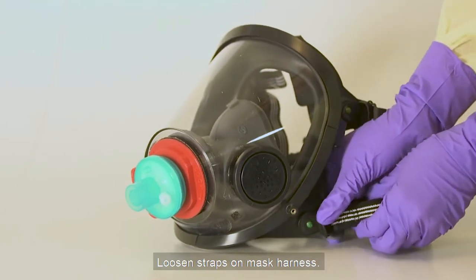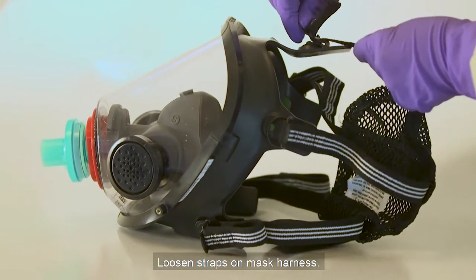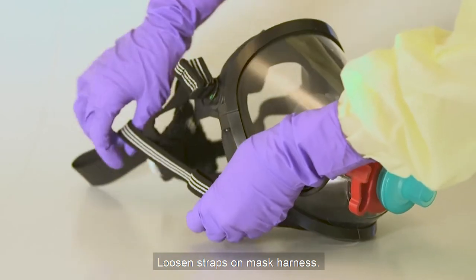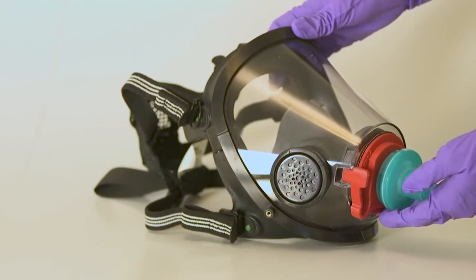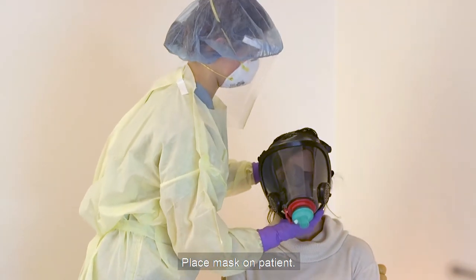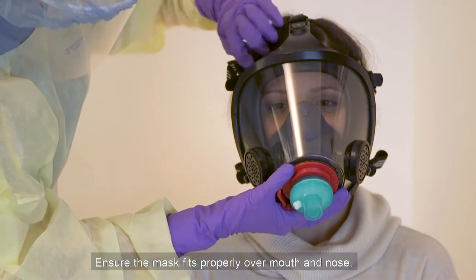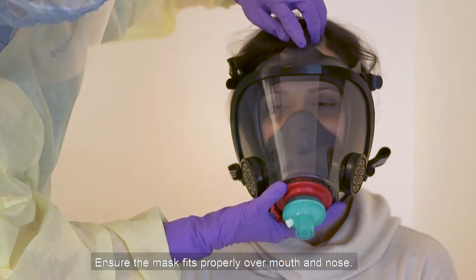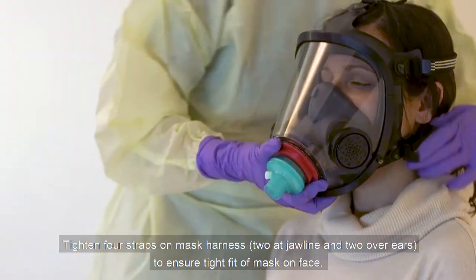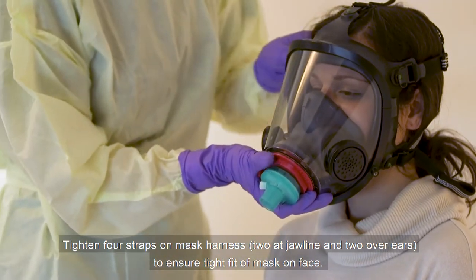Loosen the straps on the mask harness. Place the mask on the patient and ensure the mask fits properly over the patient's mouth and nose. Tighten the four straps on the mask harness — two at the jawline and two over the ears — to ensure a tight fit of the mask on the face.